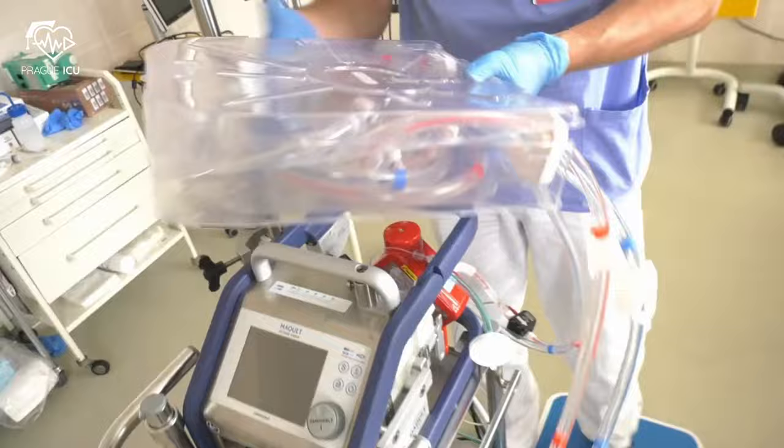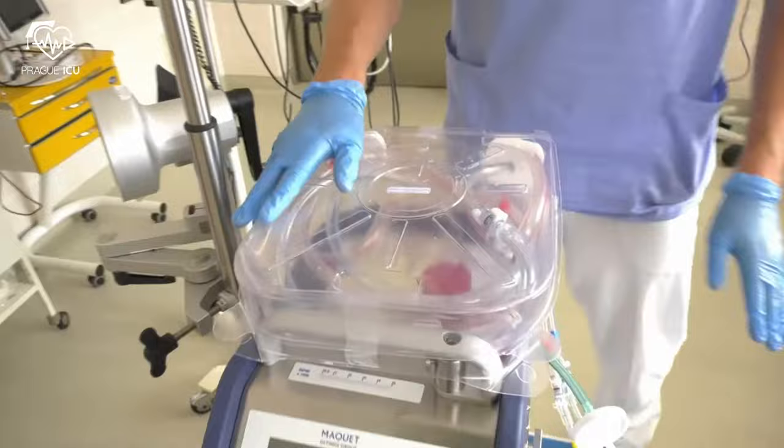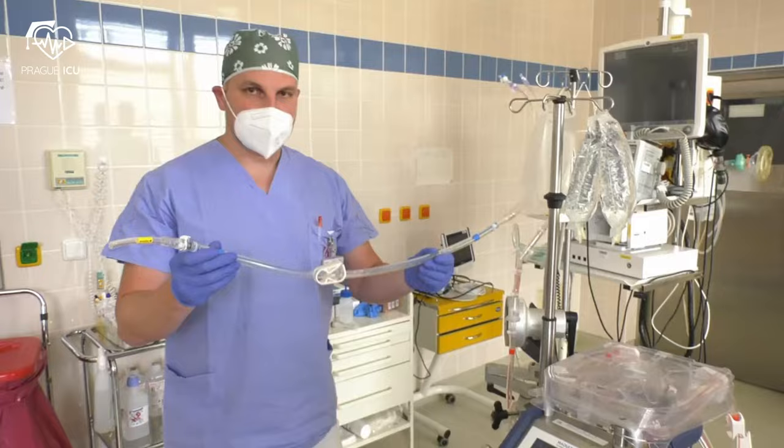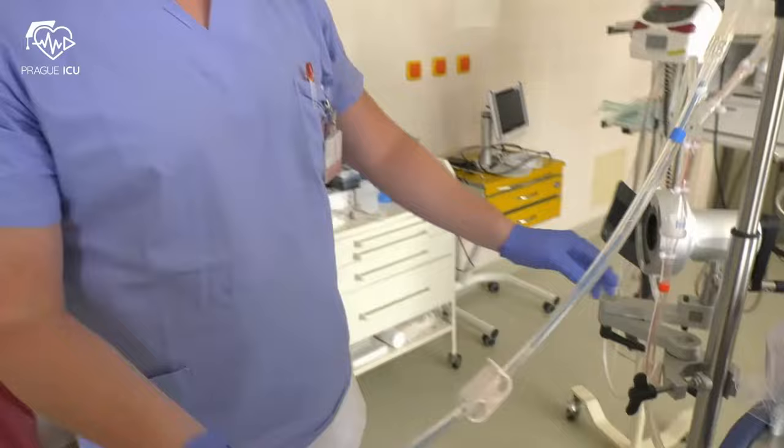Lower the Cardiohelp arm by pressing the buttons on the side and carefully place the sterile tray on top. Attach the priming bag to the infusion pole next to the bags of saline. Let air escape from the lines on the upper side of the priming bag. Close the clamp on the blue line of the priming set.